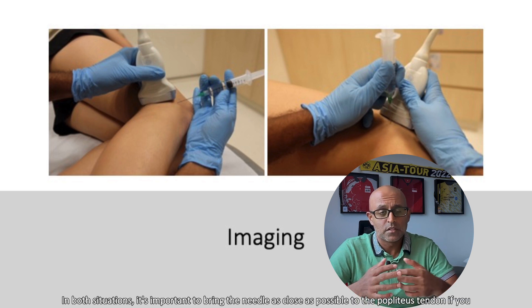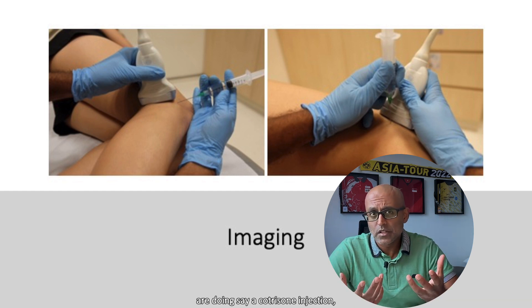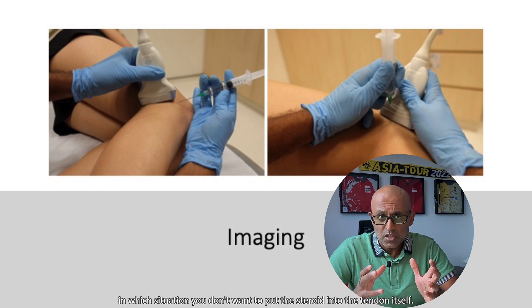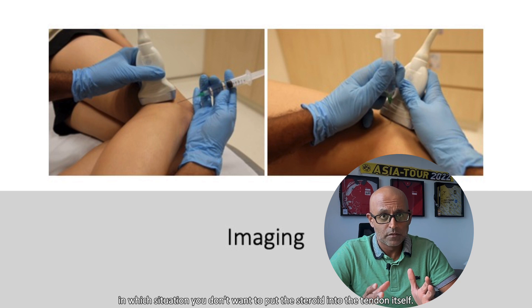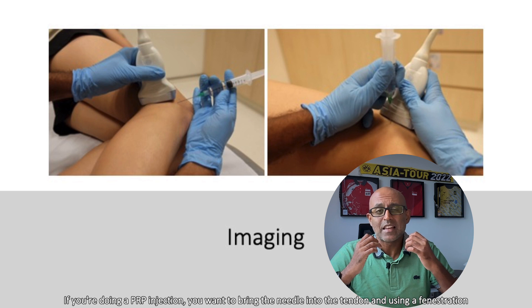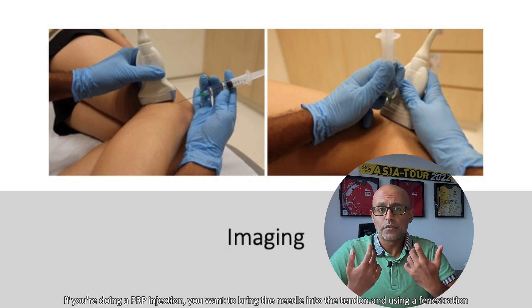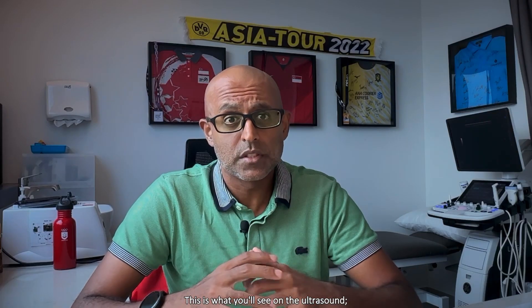In both situations, it's important to bring the needle as close as possible to the popliteus tendon. If you are doing a cortisone injection, you don't want to put the steroid into the tendon itself. Or if you are doing a PRP injection, you want to bring the needle into the tendon and, using a fenestration technique, distribute the PRP into the tendon itself. And this is what you will see on the ultrasound.